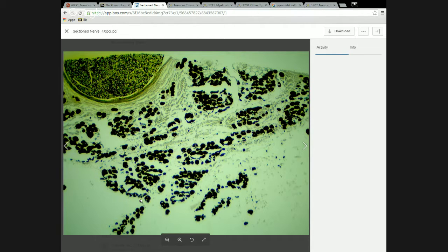It's not nervous tissue. So what type of tissue are we looking at? Besides the watermelon part at the top corner, all of the rest of the big black spots, what type of tissue is that? So what does the black tell you that we're staining? Lipids. So what type of tissue is going to have big black deposits of lipids? Adipose. Right, adipose tissue. So this nerve is passing through a little adipose tissue. It's being cushioned by fat or something like that, perhaps.